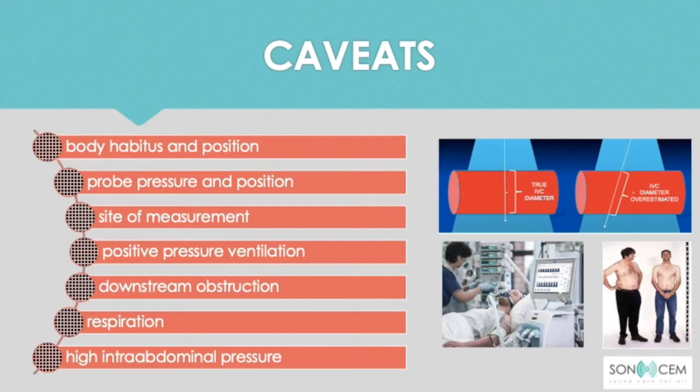IVC scanning cannot stand alone without the basic cardiac ultrasound, but cardiac ultrasound can stand without the IVC. So, for example, if you cannot get proper cardiac ultrasound or don't have any clue from it, then the IVC can give a clue in managing the patients. Okay?